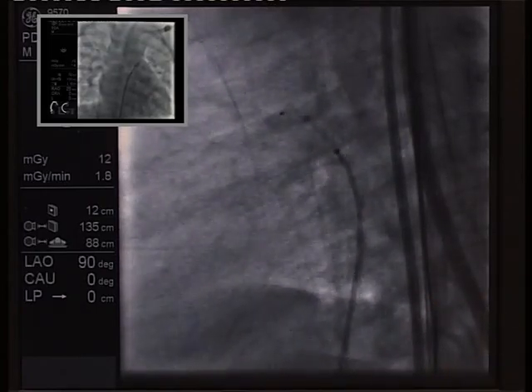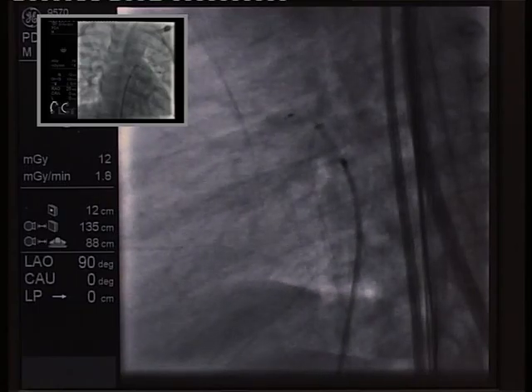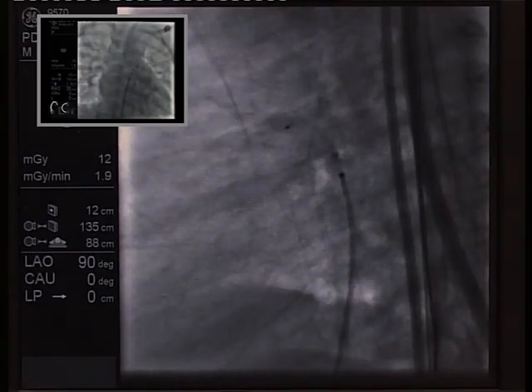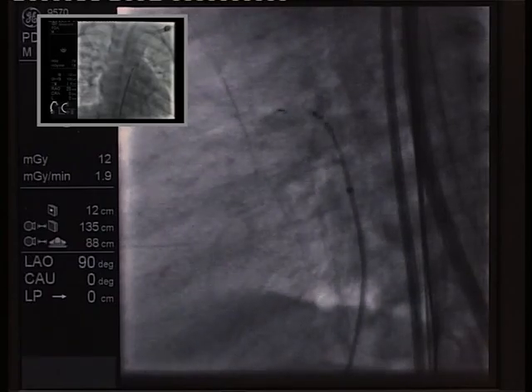Do you do biplane fluoroscopy? Do you see the fluoroscopy? Yeah, I wonder whether it's biplane simultaneous fluoroscopy. Your brain must be huge to do that.